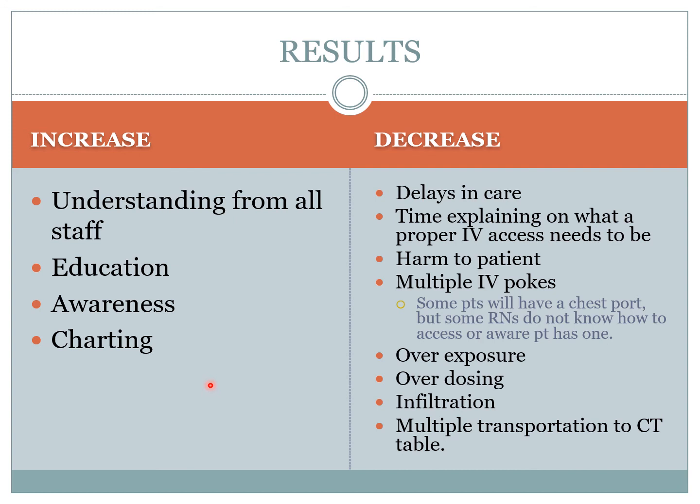Education, awareness, charting. This will all increase performance and safety to the patient. We'll be more efficient because we decrease all these delays, the time explaining what a proper IV access needs to be each time to each nurse, to each doctor.